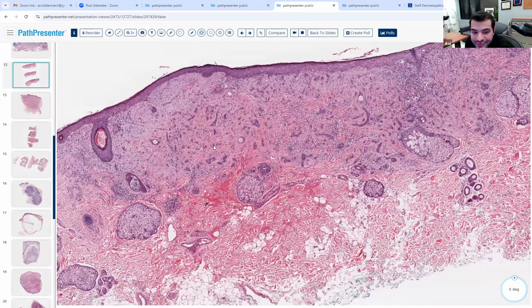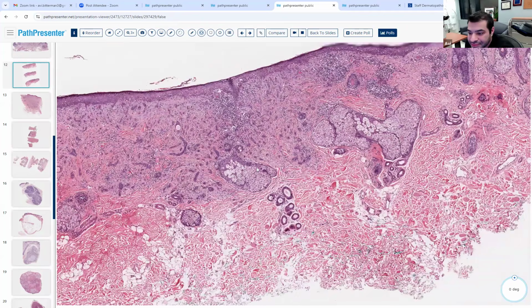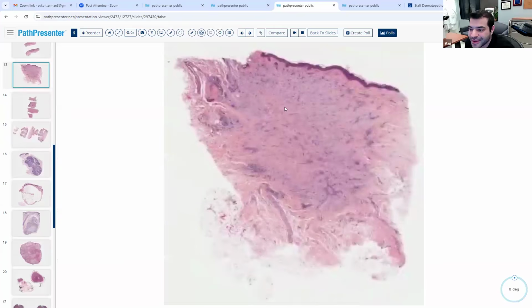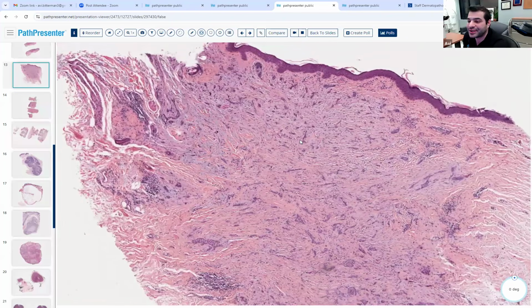I think I put this in for more of the same. Did I put this in? No, this I just put a repeat. Sorry about that. Okay. What about this one?